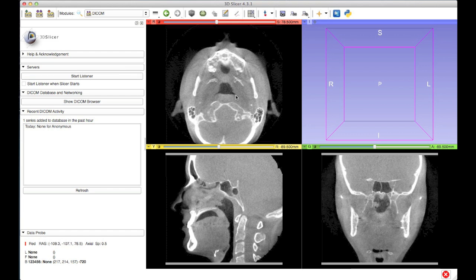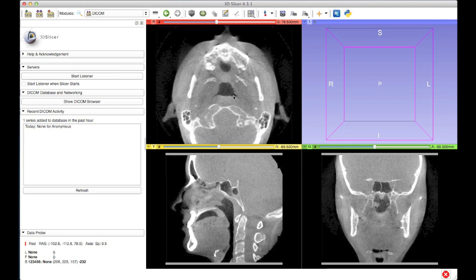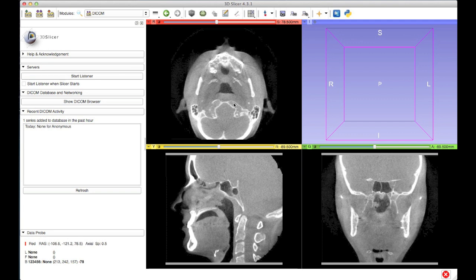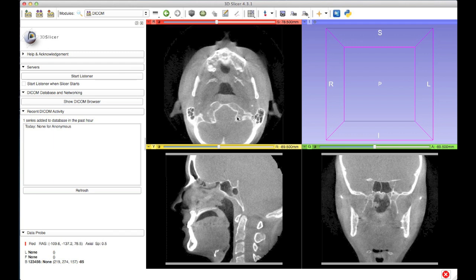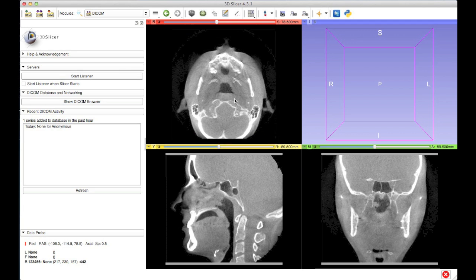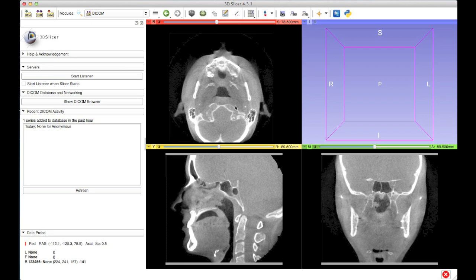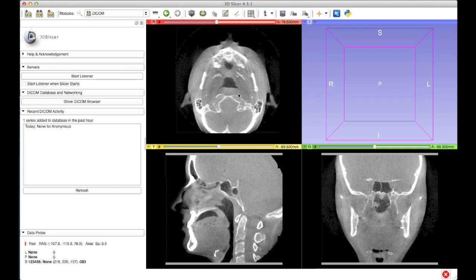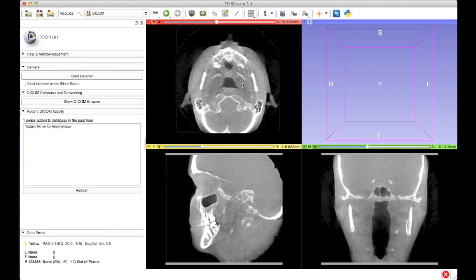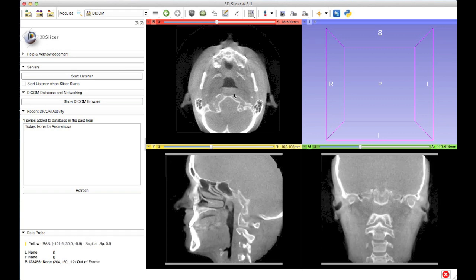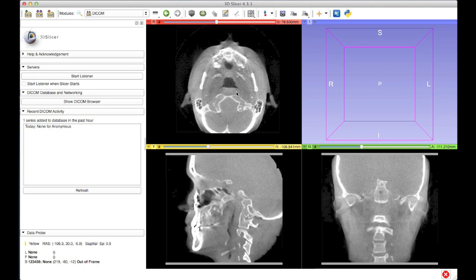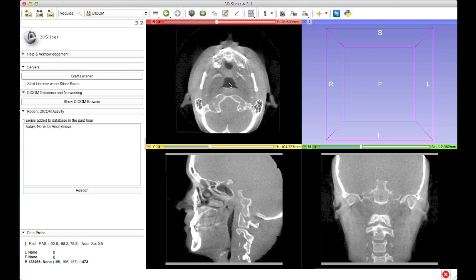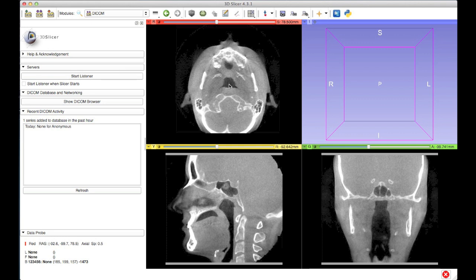If instead of a left click and drag I do a right click and drag, that allows me to zoom in and zoom out of the data. If you're using a mouse or trackpad that doesn't have a right click, you can hold down the control key on your keypad while doing a click and drag instead, and that will have the same effect. If you hold the shift key on your keypad while clicking and dragging, you can pan the data. The last thing I'd like to mention is that if you hold the shift key and hover over the data, the corresponding views in the other slices are automatically revealed — so say I'm interested in this region of the axial slice, I can simply hold shift and hover over it, and the corresponding slices are automatically shown.